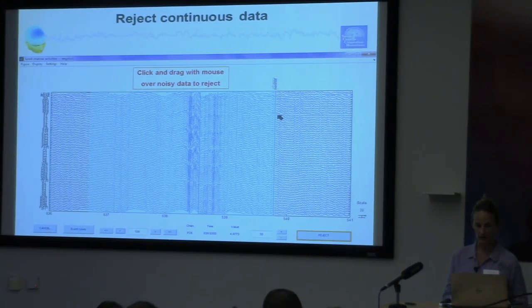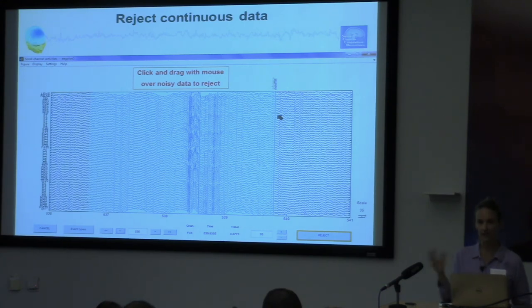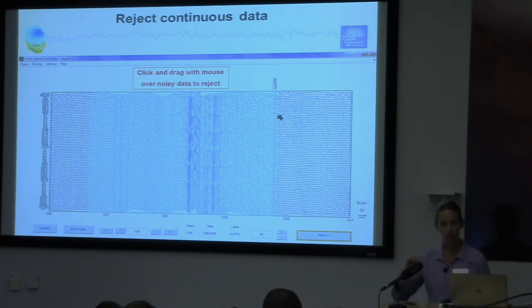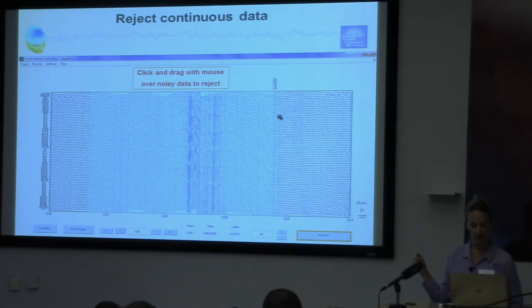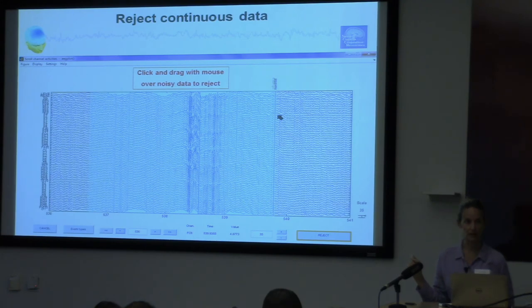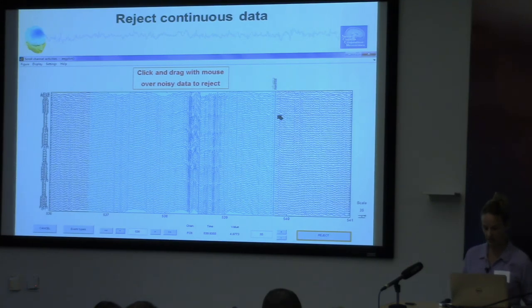Same as before, when you're done you can keep scrolling and select more parts of the data you want to get rid of. Then at the end, if you want to reject those data bits permanently, you press Reject.